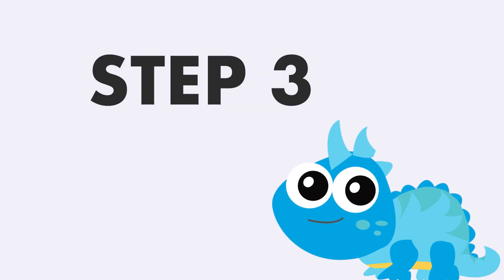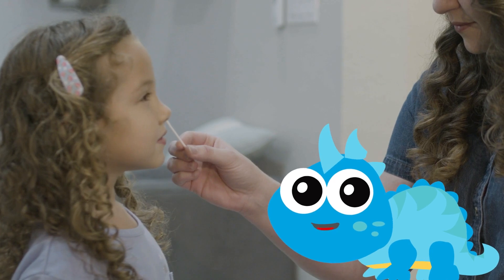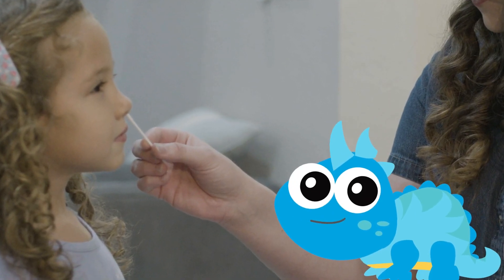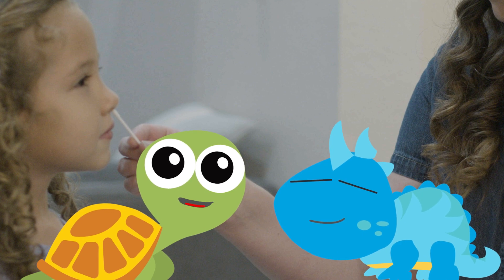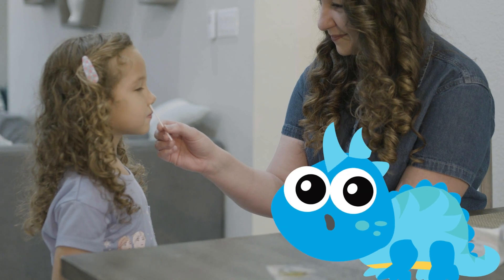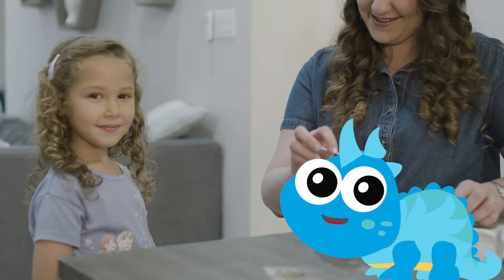Step three: rotate the swab five times, brushing it against the inside of your nostril. That looks a bit ticklish! Yes — rubbing it against the side of your nose will probably tickle a little. When done with one nostril, use the same swab on the other side and rotate it five times again.